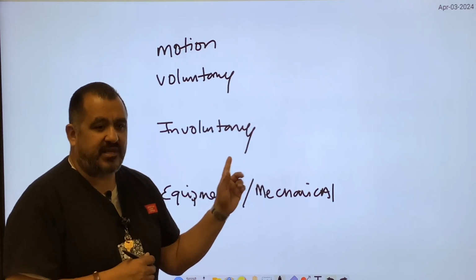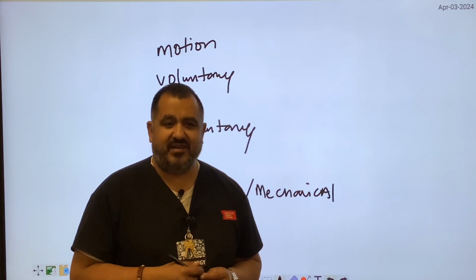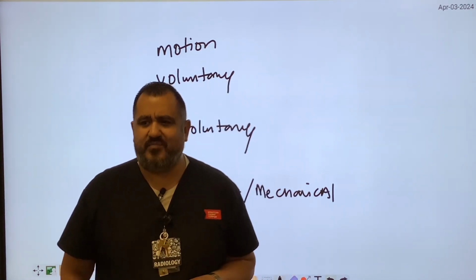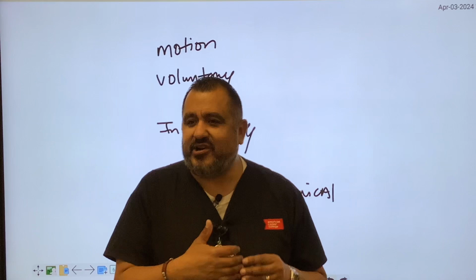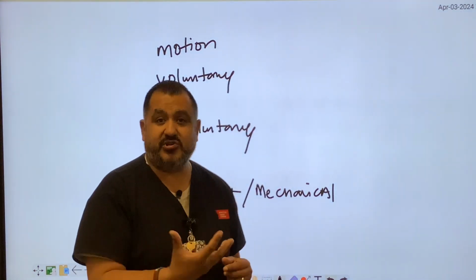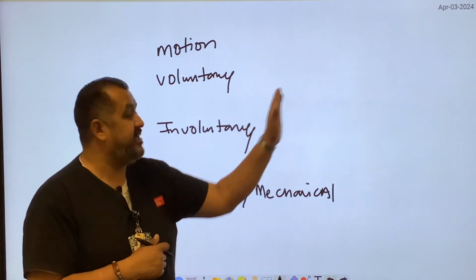Involuntary motion, they can't control it. They can't control peristalsis activity. They can't control their heart beating. You're going to tell the patient, we're going to stop your heart from beating, but don't worry, I got you, we got an AED here, we're going to get the best chest x-ray ever. No. You're going to decrease your exposure time so you don't capture that involuntary motion. So voluntary motion, we say, can be fixed by communication.